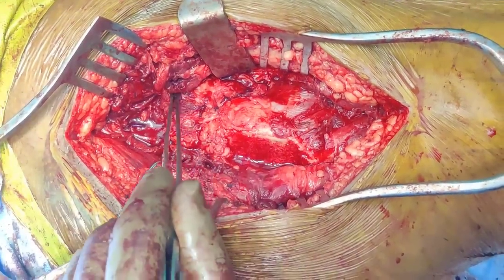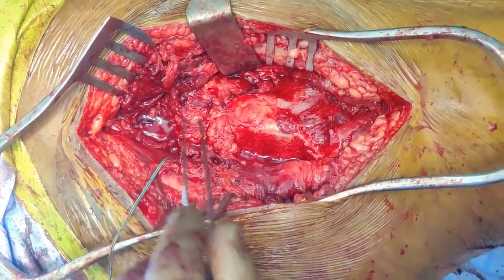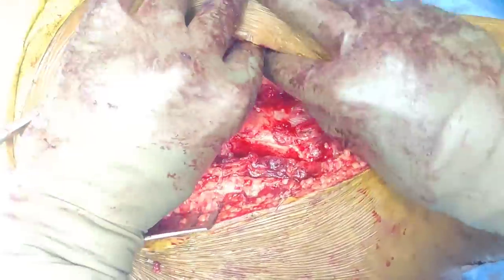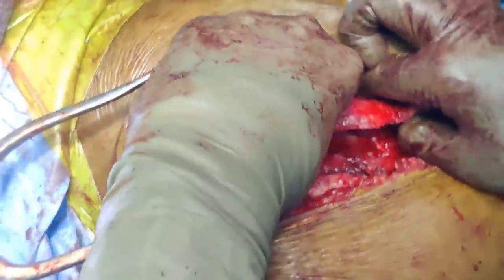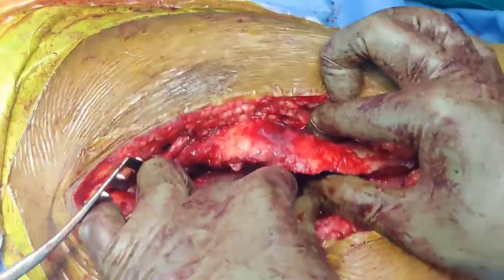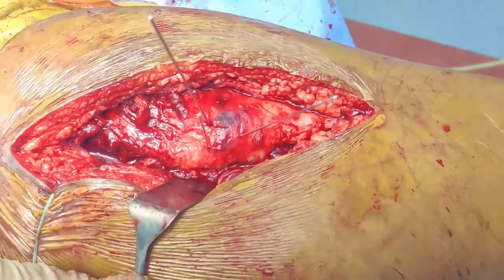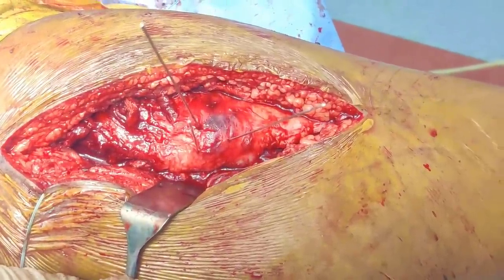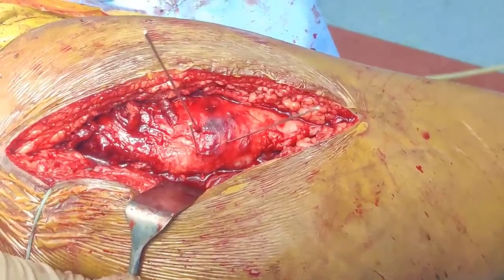This is our capsulotomy closed. The next step will be to take out the GT, oppose it, reduce it, and fix it with two or three screws. I use three guide wires and then a four millimeter partial threaded screw, drilling each of them and then putting the screw.